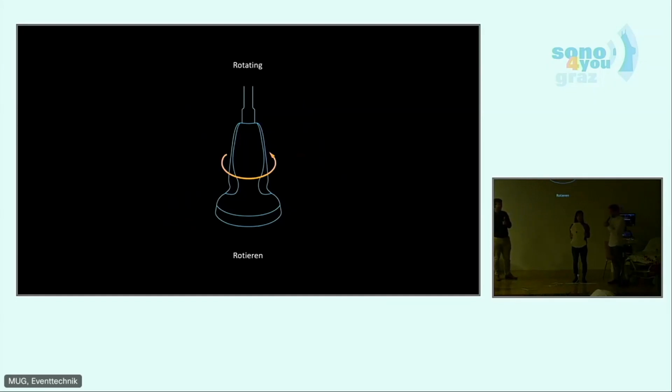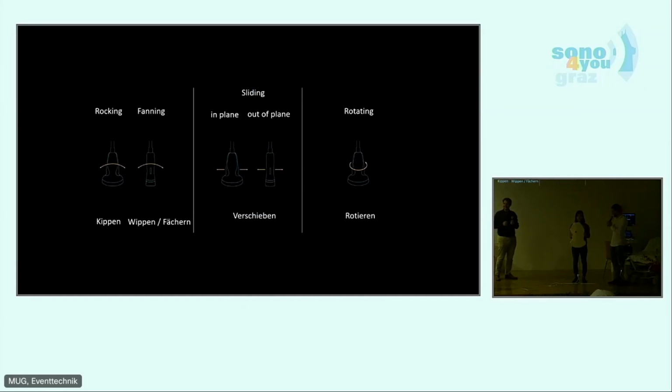So we have fanning, rocking, sliding in plane, out of plane, and rotating. I think to get a little bit more interesting, now we should blindfold you. We take care of you. No worries.